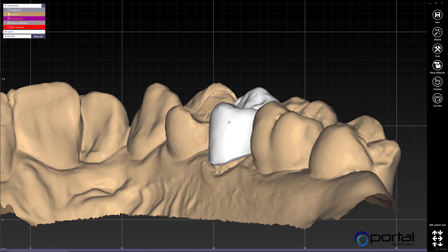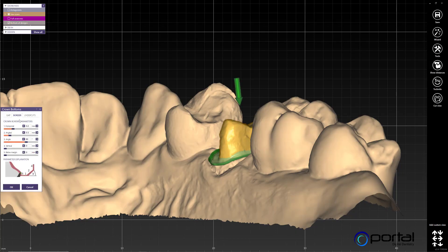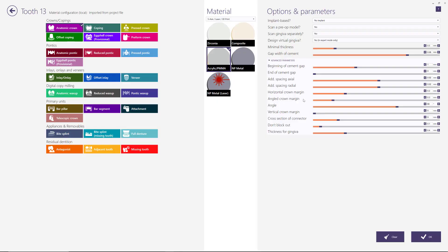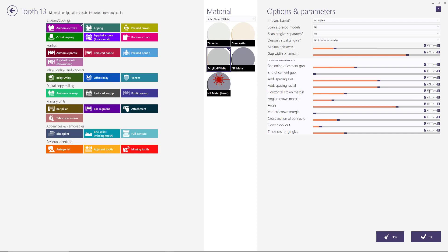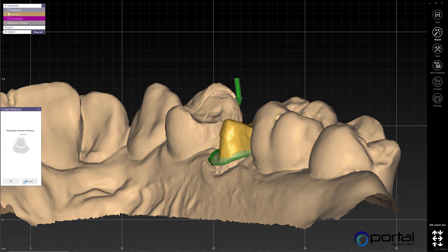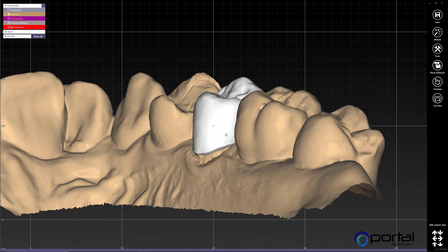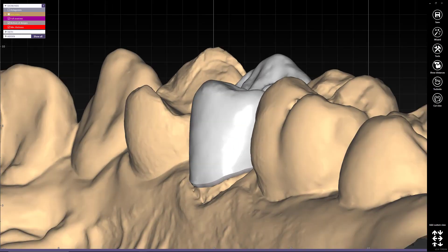We will right-click on the tooth and go to crown bottoms. In crown bottoms we have access to the border parameters, which is what we were looking at. One of these that changes is the horizontal crown margin, and it went from 0 to 0.2. So we can go here to the design and change that — set my horizontal to 0.2 — and then click OK and it'll apply those settings and readapt our design to the new settings.